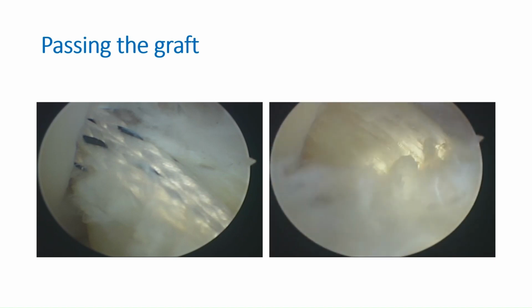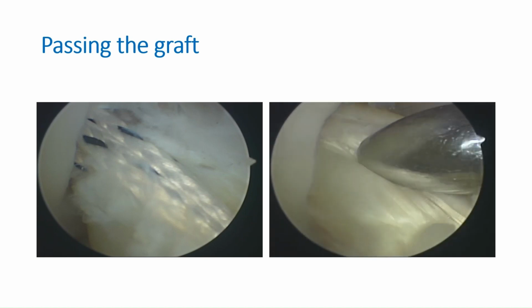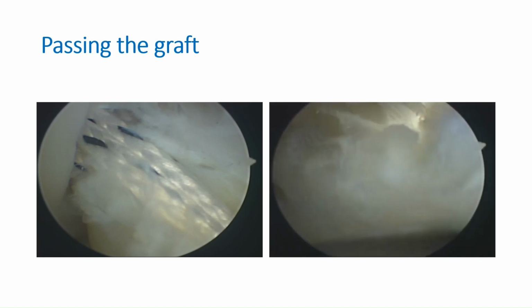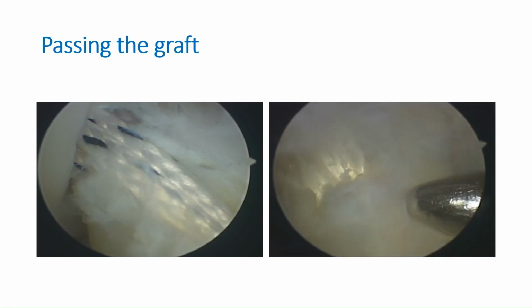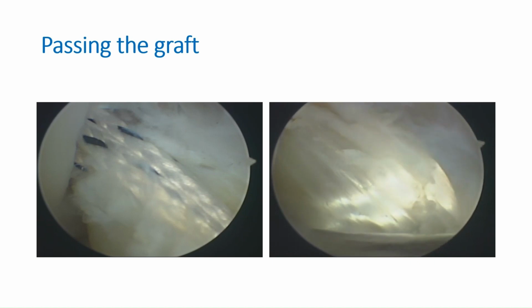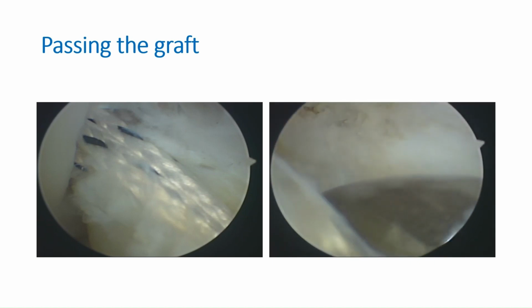One would say, but I have not seen the femur as clearly as I want. Once you've seen the lateral intercondylar ridge, it's fine, because all you need to do is to go below it. You don't need to remove the fibers that are even lower and expose the posterior articular surface and see the popliteal fossa and your over the top position. You don't need to do this.